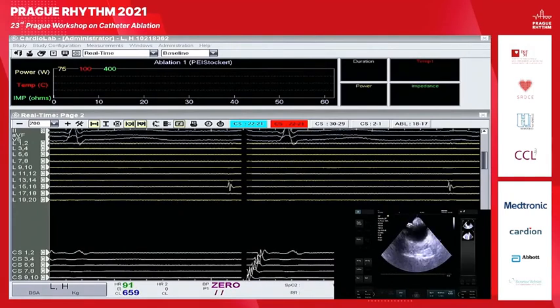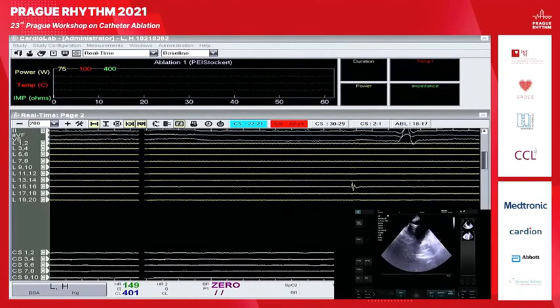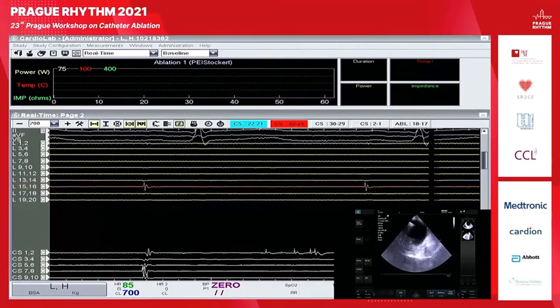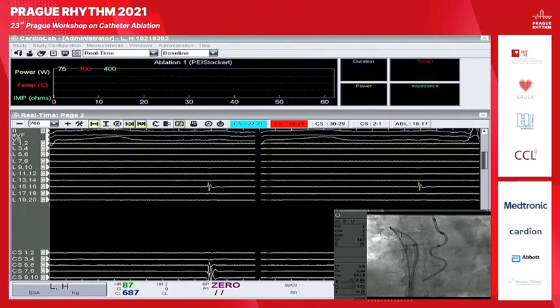Okay, and we have still some potentials on the right superior. But it's very far field, so should we maybe try to pace from? So can we justify this far field or the real stuff? Can you show me at least the baseline? Let's pace CS1-2 just to exclude this far field from right superior, right? Right atrium.